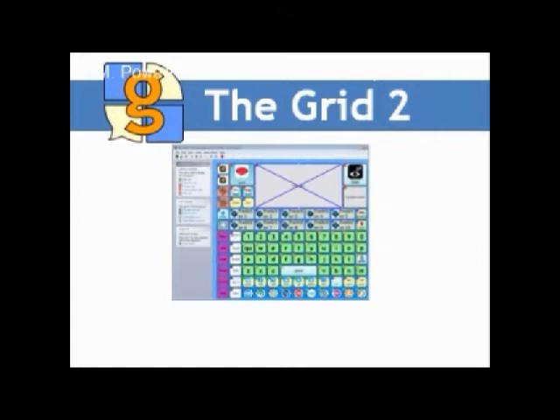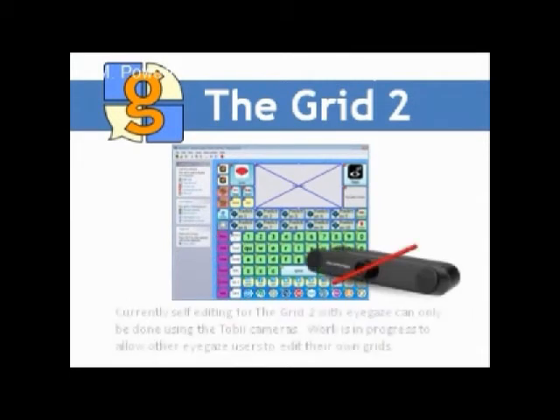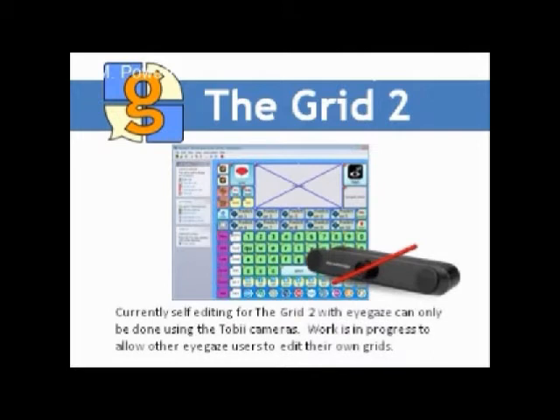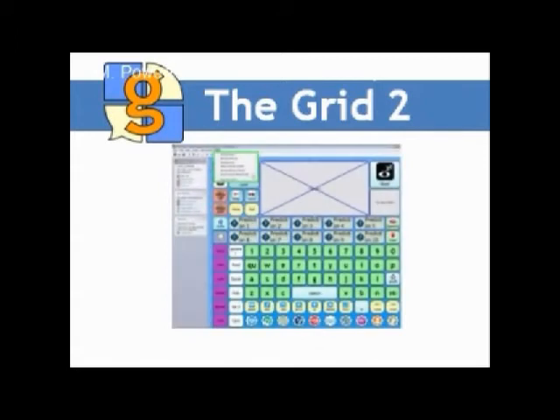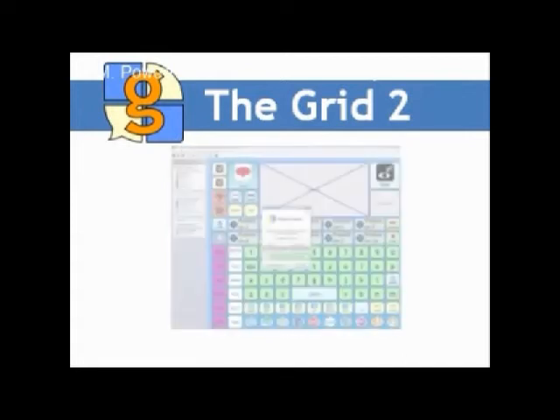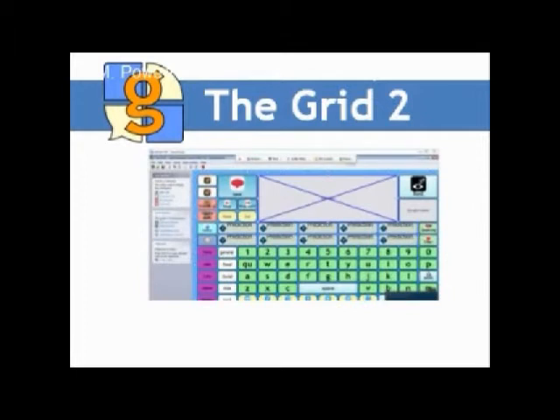The only significant weakness of the software is the inability to undertake these modifications using eye control. You have to use a mouse. So I was acutely aware that I only had limited time to get everything right before I totally lost the use of my hands. I know that Smartbox would have been able to make these modifications either with me or remotely, but it would have been incredibly frustrating trying to explain what was required.